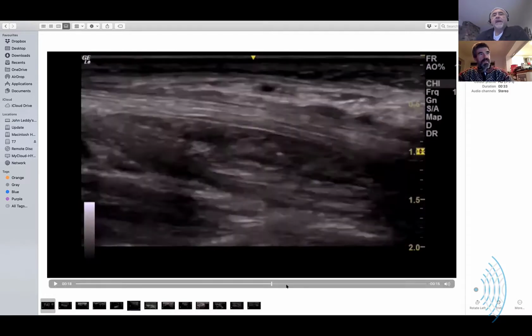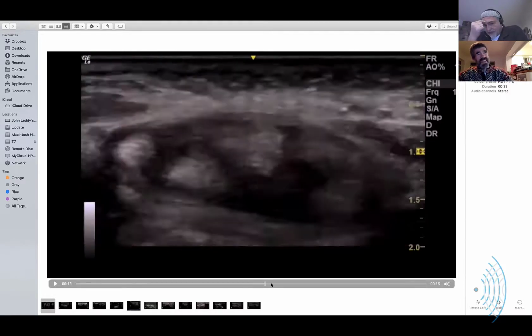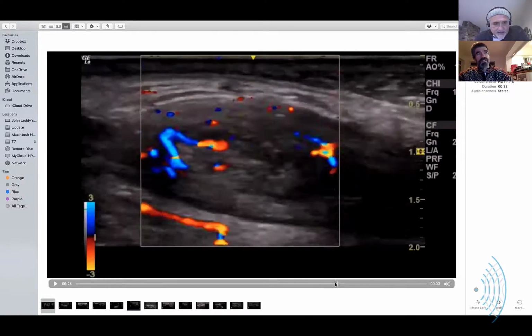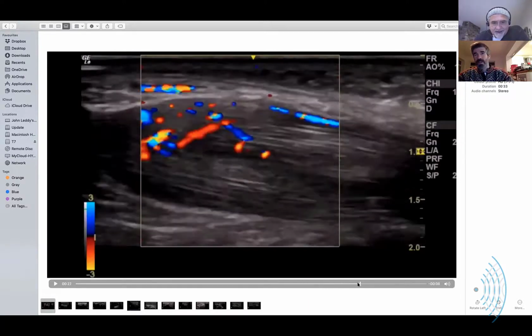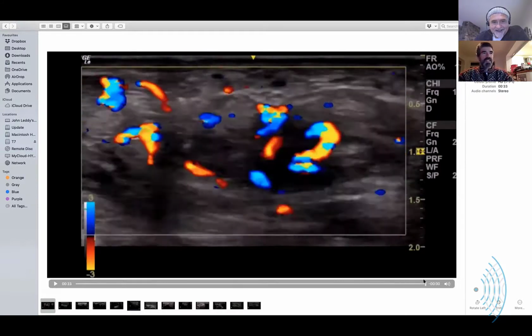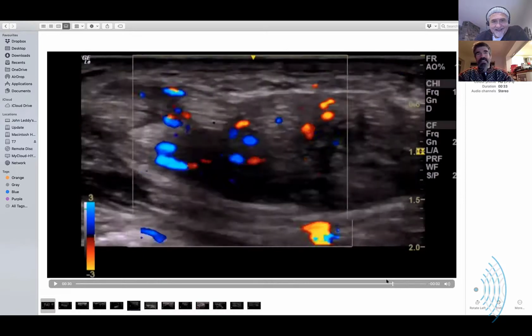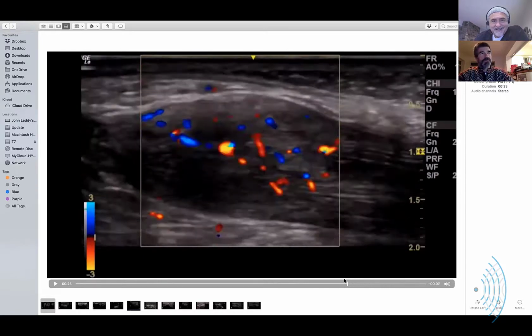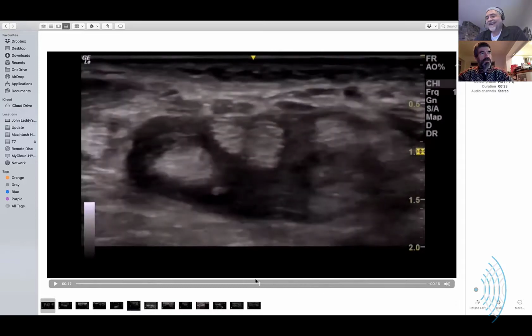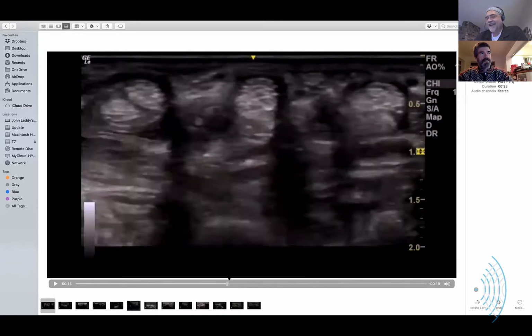I'll stitch that, and then there it is in long section. And you have to be paying attention to notice that. Surprisingly, it's really obvious when you're shown it, but when you're scanning and you're not expecting to see it, you have to force your mind to pick things up like that, which is why I show it.